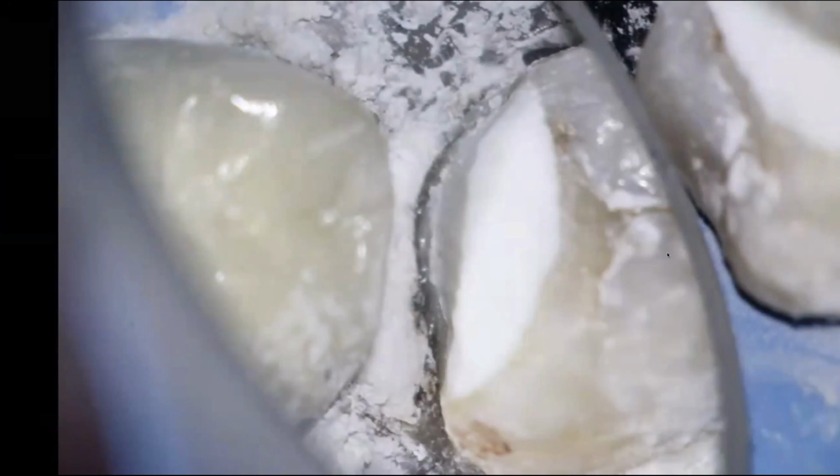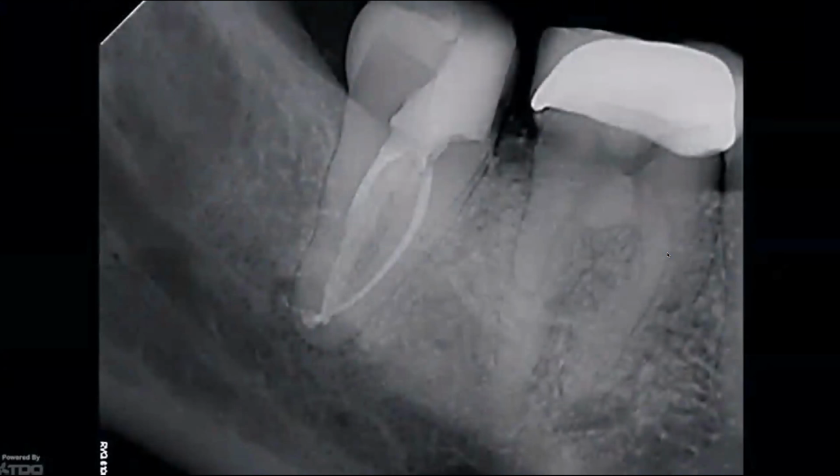So in this case, I'm placing the margin onto tooth structure. Placing the finish line onto the tooth structure gives a very clear indication to the restorative dentist as to where they can start their margin. Since it's done on the microscope, it becomes a lot easier for them to work. And for the practitioner placing the margin, you could see a very clear distinction between tooth structure, Cavit, and stark white buildup material. So that's the final right there.